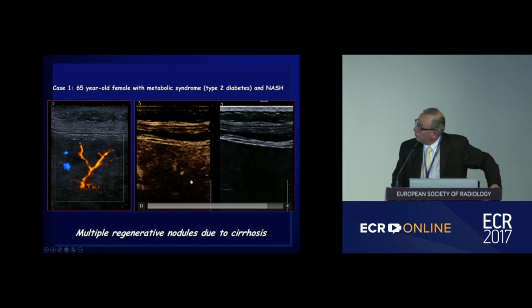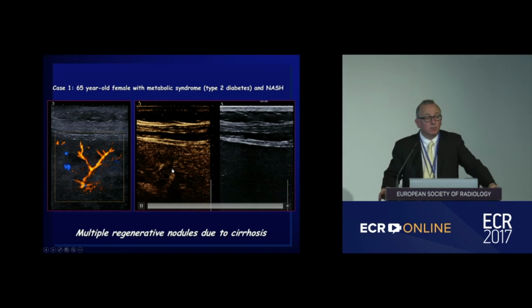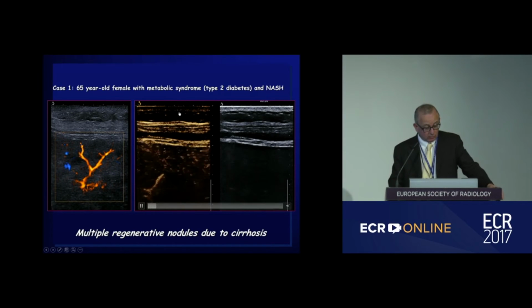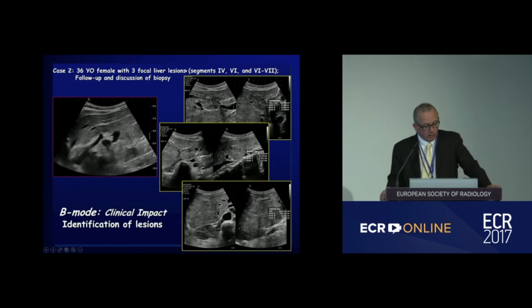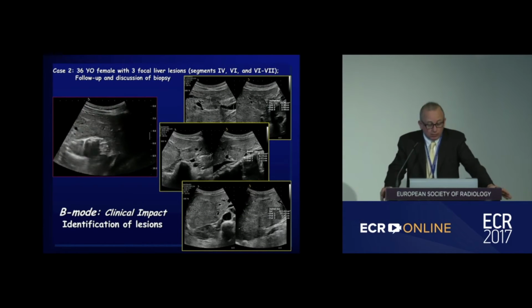Just to let you evaluate all of these small nodules inside the distal and subcapsular areas, just showing that this is truly a patient with a cirrhotic disease. So this is exactly what we do in our routine practice.